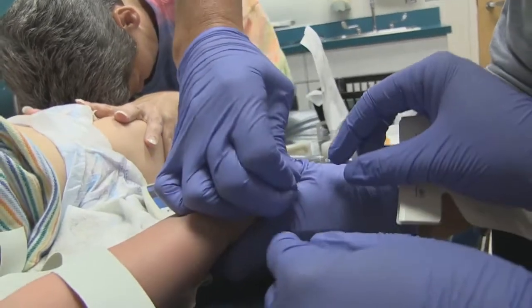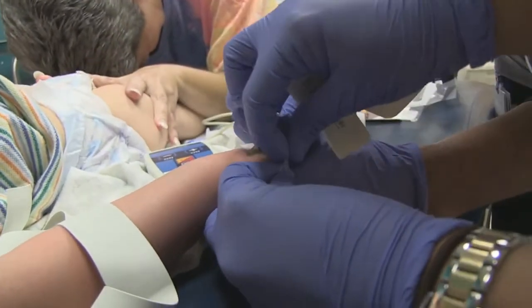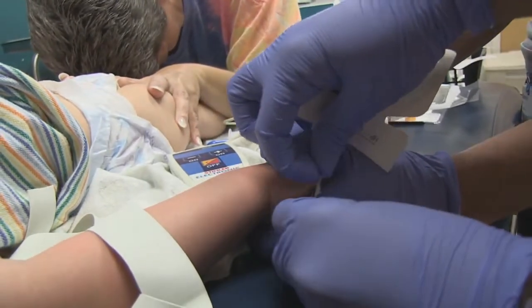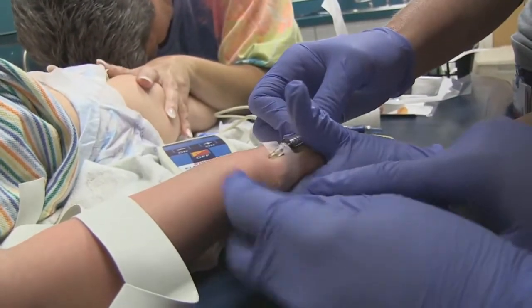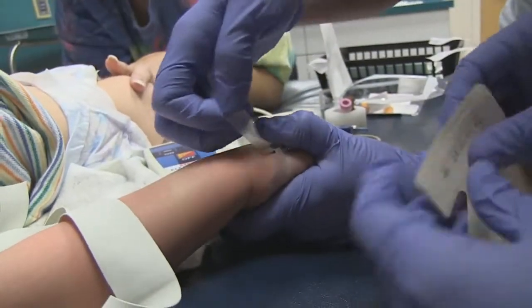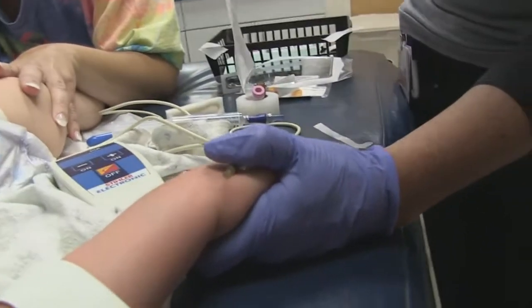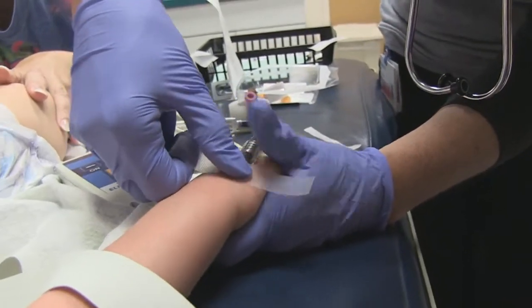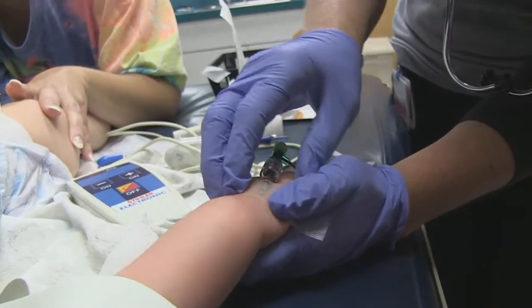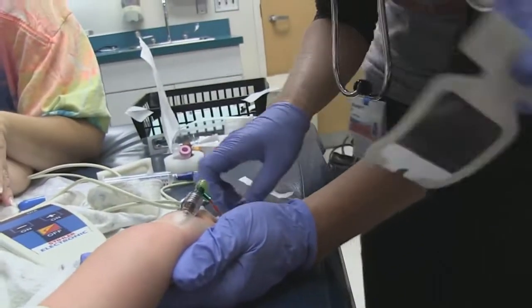This is one of the complications of taping — you get your glove caught. I'm going to hold down if you can get it off. There we go. I want to re-tape that just because it's kind of not holding. I'll just re-anchor it a little bit.